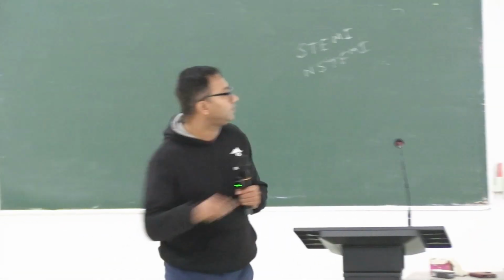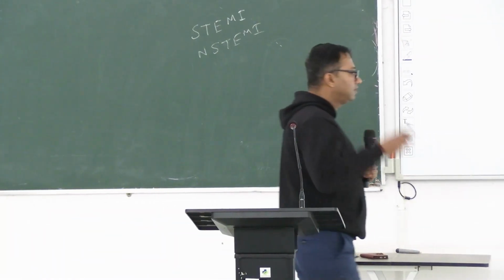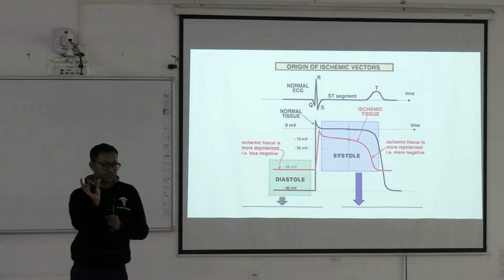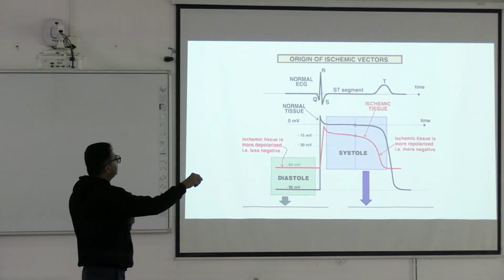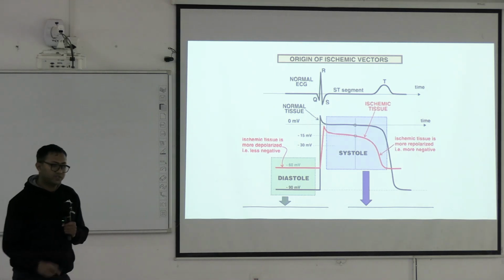Okay. So phase 4 is basically a part of diastole, correct? And you know that the QRST complex is ventricular depolarization and ventricular repolarization. The QRST duration is systole. The P wave is not shown here, because the P wave occurs when the ventricle is in diastole.